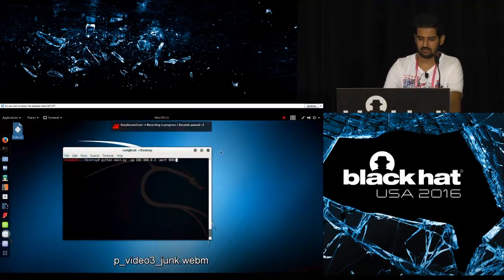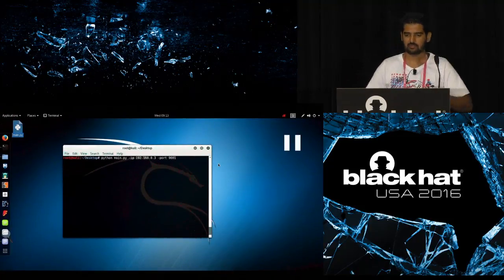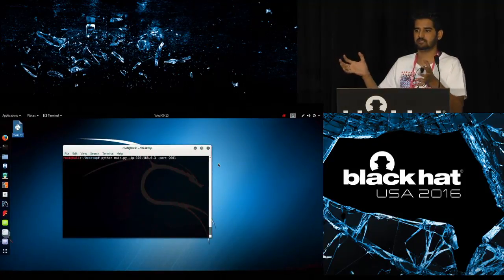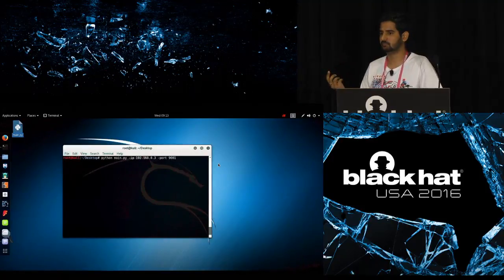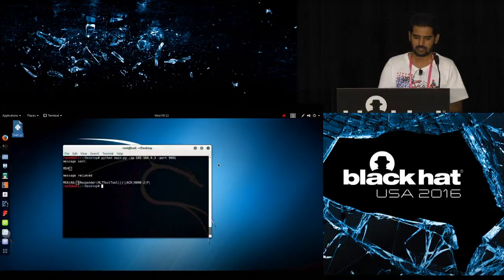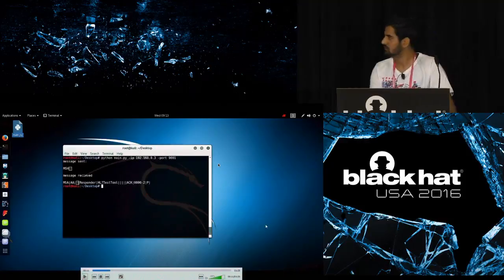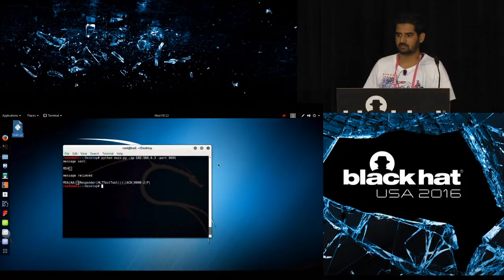All right. So this is an interesting demo. Every IP can have multiple HL7 ports, or it can have multiple HL7 messages sent to the same port. For the sake of convenience, I'm running 3 different ports. This is the second port that we're talking about, port 9001. This is an emulation tool that I'm running. I will release this soon also. So I sent a message and it just responded like that. It says I acknowledge the message.